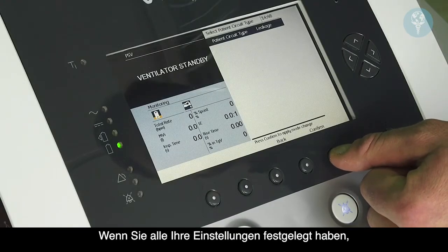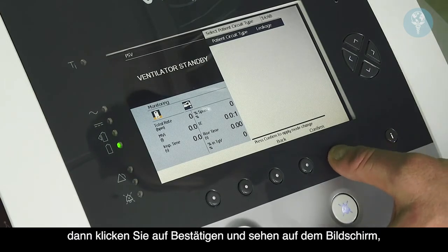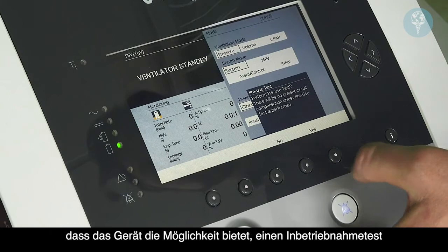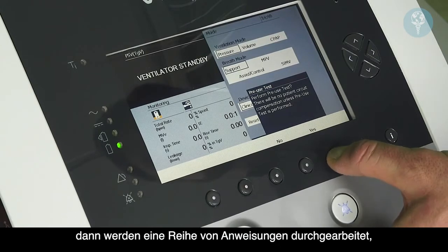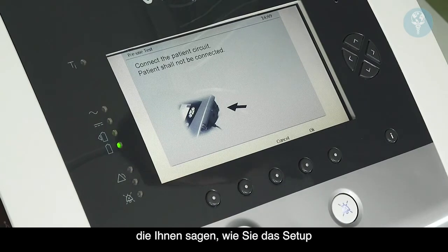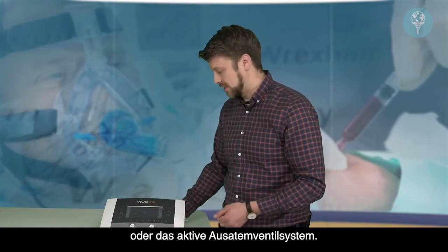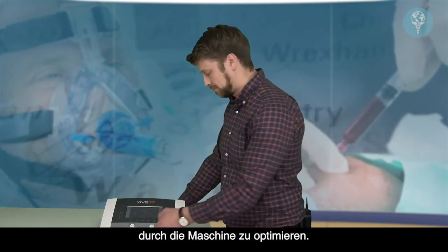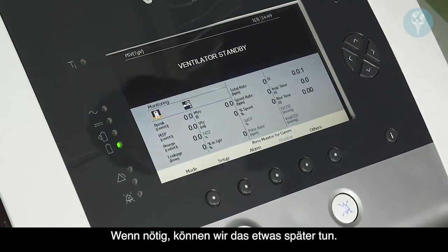Once you've established all of your settings, all of your alarms and the circuit type, we just click confirm, and you'll see the device is offering the opportunity to do a pre-use test on the screen. If we selected yes, it would work through a guided series of instructions telling you how to set up the circuit that you're using, either the leakage circuit or the active exhalation valve circuit, and it will measure the resistance of the tubing in order to optimize the treatment that we're delivering. I won't run through the pre-use test right now. We can do that a little bit later if needs be.